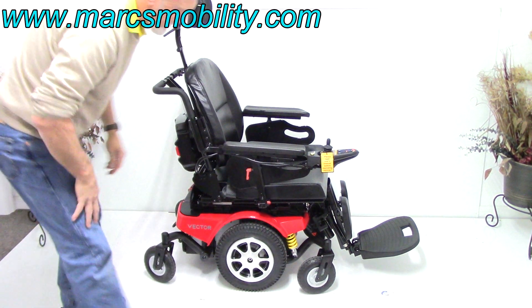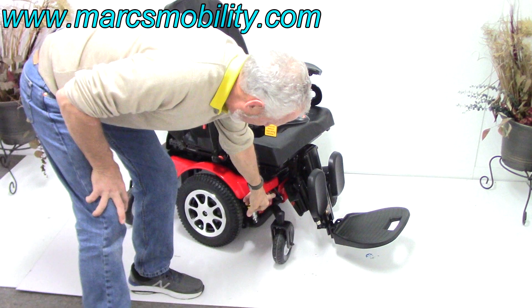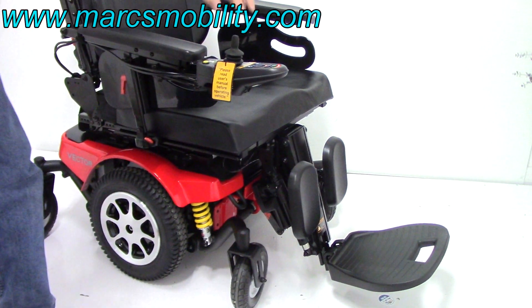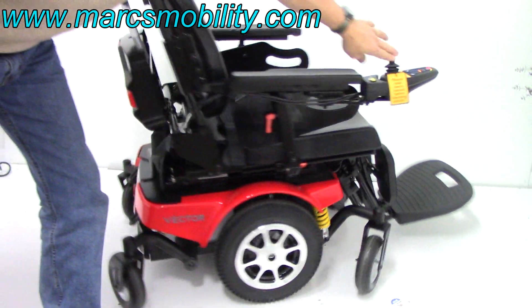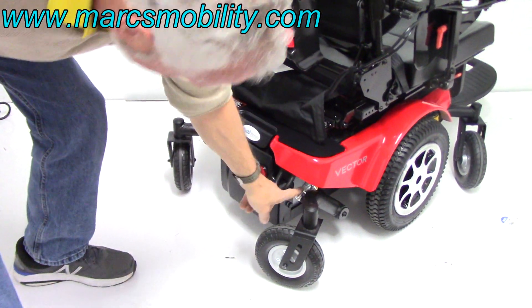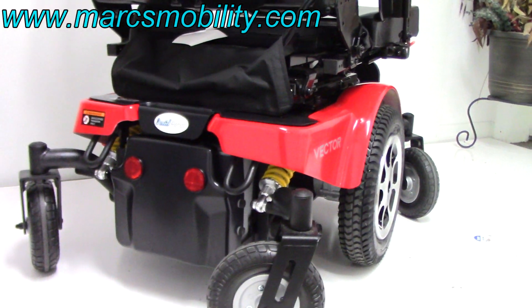This chair also has anchor points — two in the front and two in the back, welded to the frame. You can see the spring coming from the back wheels and the shock back there.